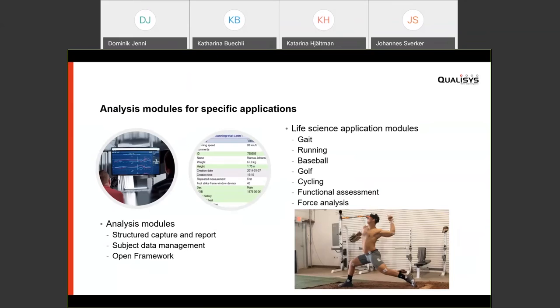For different life sciences applications, Qualisys has something called analysis modules — a way to organize your capture and reporting. They're not a requirement, but they make it easier to manage subject data. It's an open framework, so you can make your own module, but specific modules are available for gait, running, different sports, functional assessment, and force analysis.